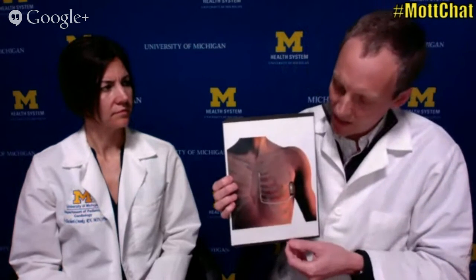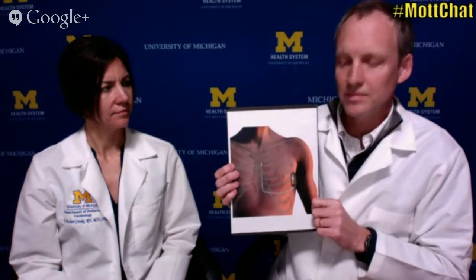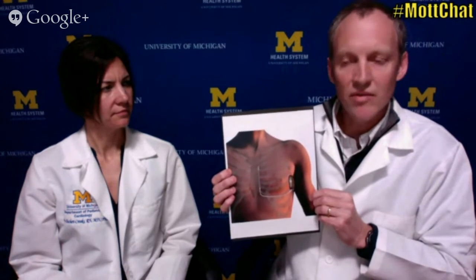Here's a picture of a subcutaneous ICD. This is the ICD here, and it would be underneath the skin. And the wire goes along and underneath the skin in the area of the chest, but actually in front of it.